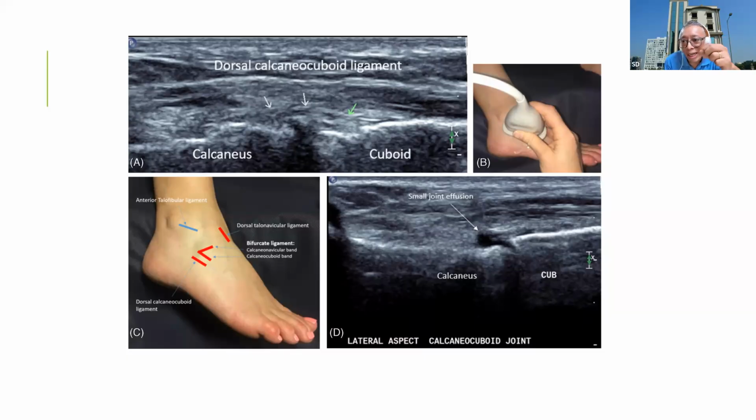If you are going inside the plantar fascia, go with PRP. If you are injecting steroid, you should inject above and below the plantar fascia, not inside it. So if you are injecting steroid, always go above the maximally fusiform dilated part, and below the plantar fascia, not inside. But if you are using PRP, you have liberty to go inside the tendon and do multiple puncturing where there is maximum fusiform dilatation, and inject the PRP where you suspect injury to the ligaments.